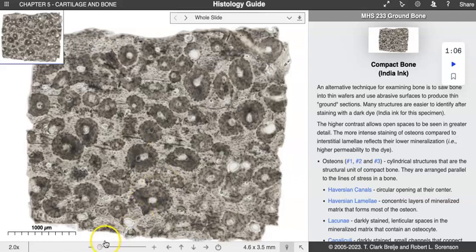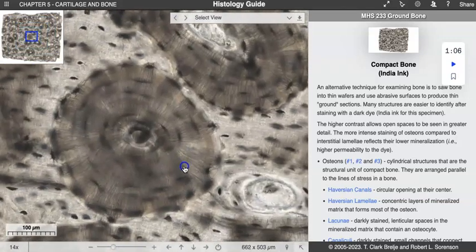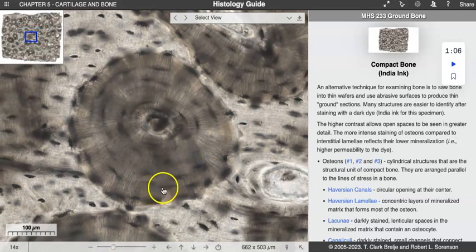So why don't we go ahead and zoom in and look at maybe one of these osteon units. You can see that there is a uniform pattern through all of them. They're not all exactly the same size either, which is interesting to note. We can see this central section. We have all these rings, and then we have all these little black dots all over the place. So let's take a look at our one osteon, and actually it zooms in quite nicely right where we're going.